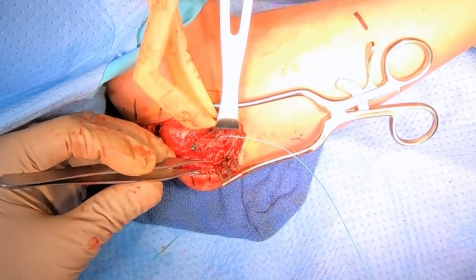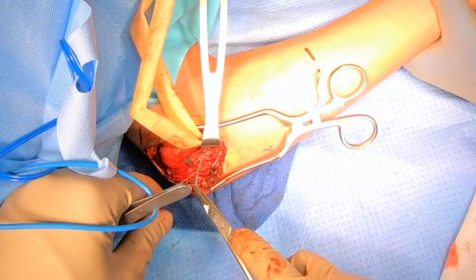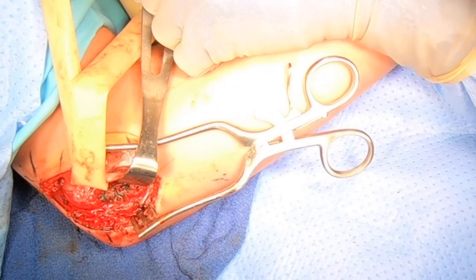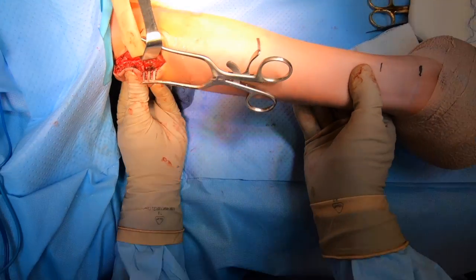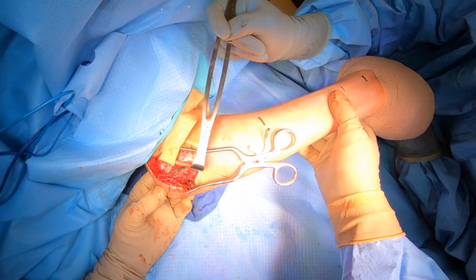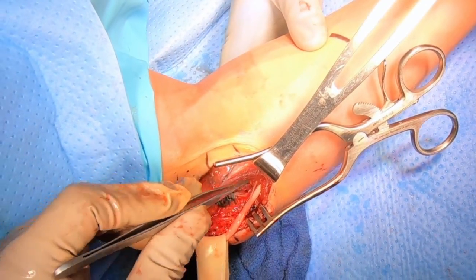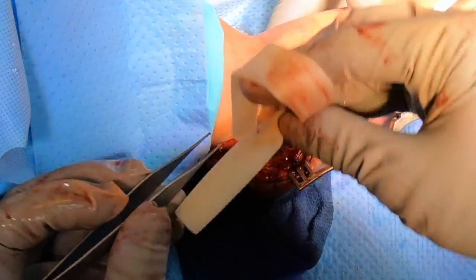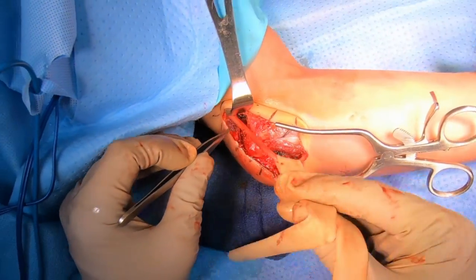You'll see me here now sewing the tape to the native ligament. This tape is coated in collagen to make sure that it incorporates with the ligament and augments our repair. You can see our completed repair — the nerve is pulled up out of the way, and the tape is over the top of the ligament repair. You'll see me here confirming that the elbow still has full passive range of motion, that we haven't constrained the elbow or created any abnormal kinematics. Now we'll inspect the nerve and make sure it looks healthy all the way down toward the lower arm bone and up toward the upper arm bone. The nerve here looks really good.